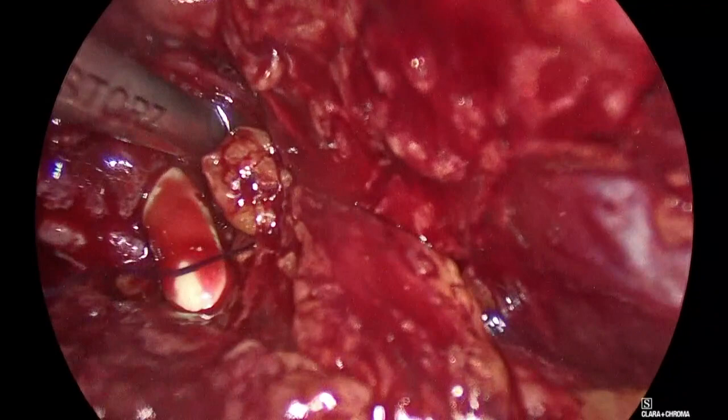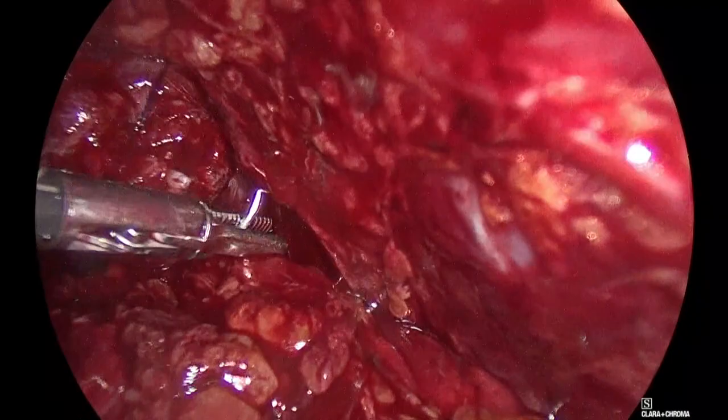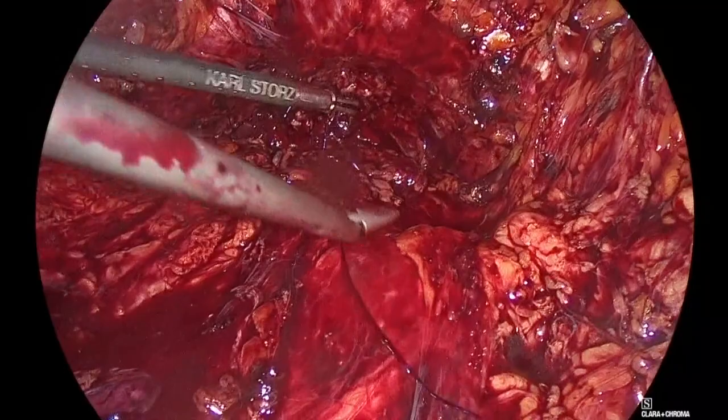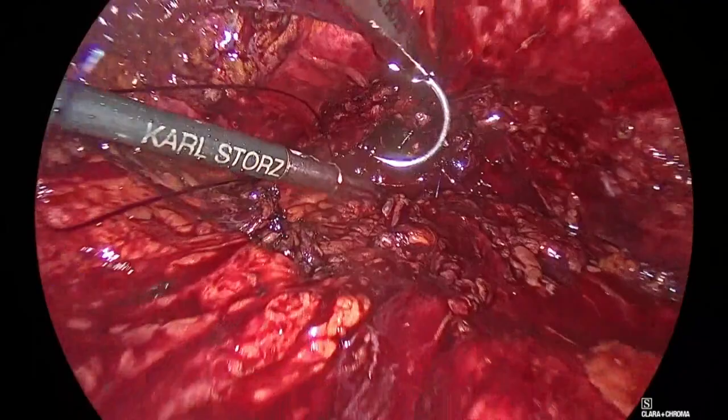Catheter back, please. Catheter back, good. Release, good. Let's go back. Panagiotis, your suction out of the way. Good. Needle. So it's very important, these two initial sutures, you need to have a tampon on the urethra to get two good bites. Come in.